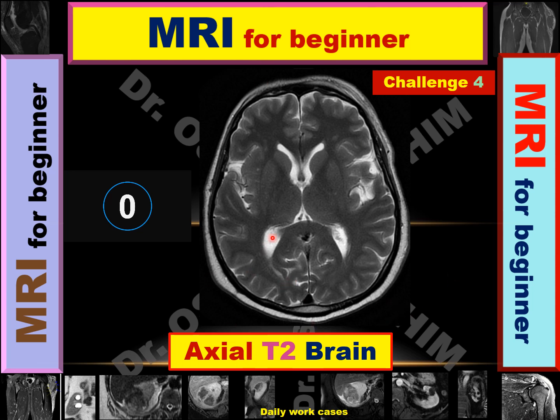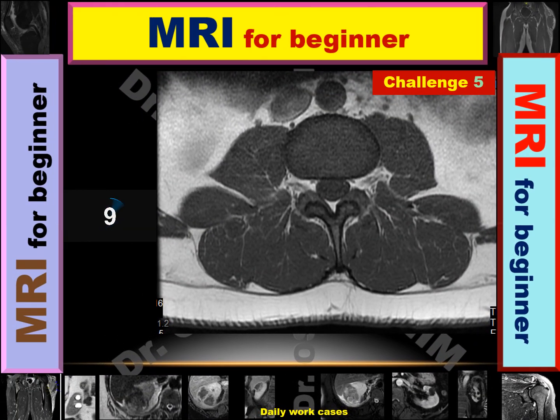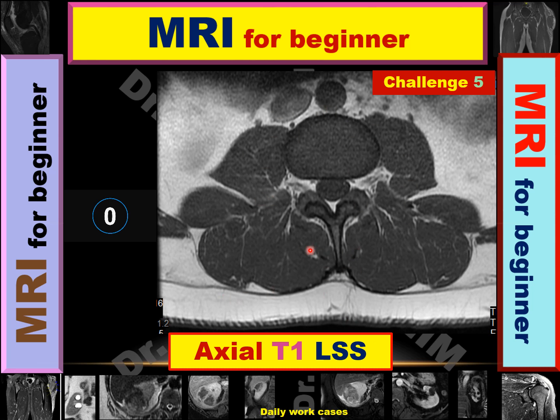Axial T2 brain. Next, an axial image because it looks like CT. T1 because only the subcutaneous fat is bright. However, the CSF in the spinal canal is dark, and this is the lumbosacral spine. So axial T1 lumbosacral spine. This bright tissue is the epidural fat, and this is the mesenteric fat or paraspinal fat, and this is subcutaneous fat. The one element, fat, is bright. However, the fluid appears dark, so this is T1.